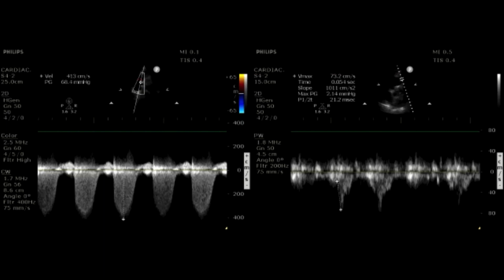There was a question in the chat box about right ventricular dilatation and the D-shaped septum and what the value of that is. We typically see that in patients that have chronic right ventricular overload, but it can be seen in patients with acute PE. So by itself, it's really difficult to assess. It doesn't really add too much. We know that the right ventricle is bad. That's all you can say. And it can occur in the acute phase and the chronic phase as well.